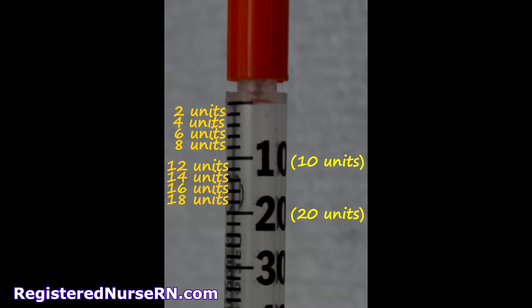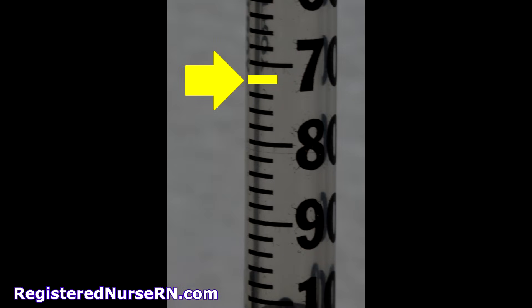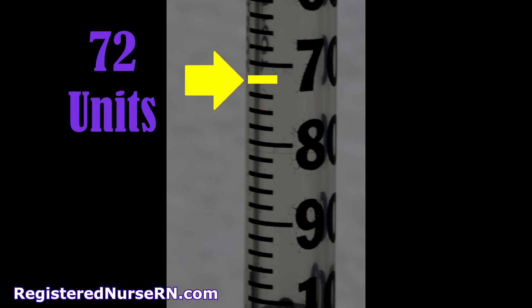This is our last syringe — one you will use a lot when giving diabetics insulin. It holds a total of 100 units, because insulin is measured in units. It looks similar to our 1 mL syringe, but it's not measured in mLs — it's measured in units. The top line is 0, and it measures in increments of 2: so 2 units, 4, 6, 8, 10, and onward to a total of 100 units. Based on the yellow line, the answer is 72 units.